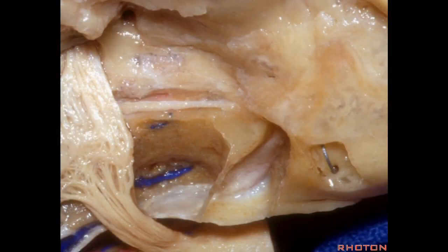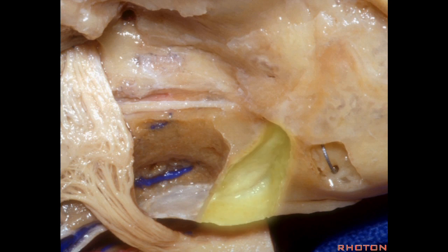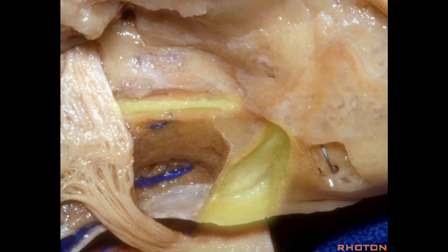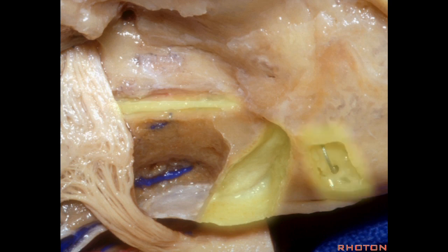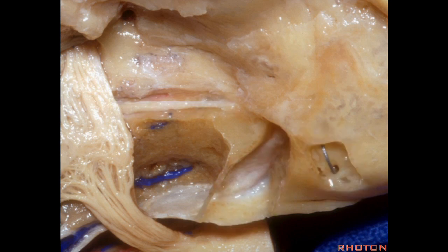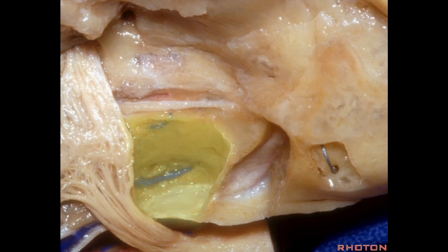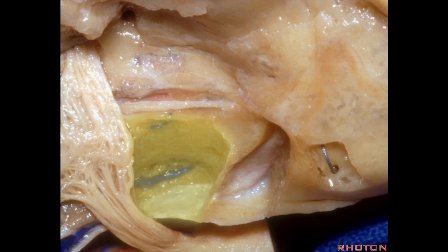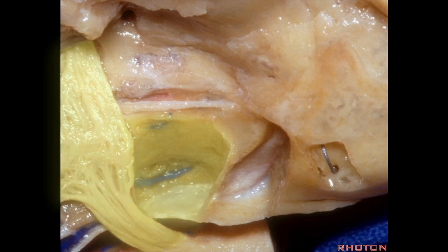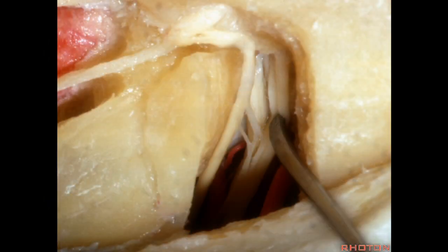The two most common approaches we take to this area are either the approach to the internal acoustic meatus, bisecting the angle between the greater petrosal and arcuate eminence that overlies the superior canal — we begin drilling at the petrous ridge and work toward the fundus — or for the anterior petrosectomy, we drill medially under the trigeminal nerve, down to the side of the clivus. Here we've opened the meatus, working from porous to fundus.